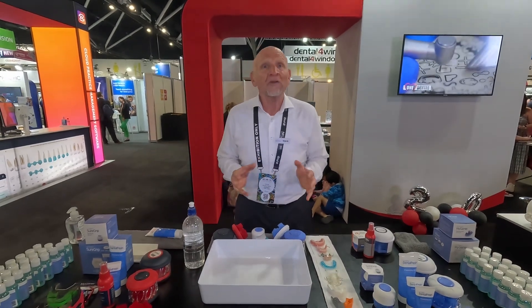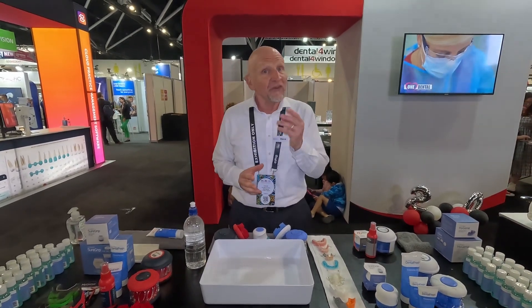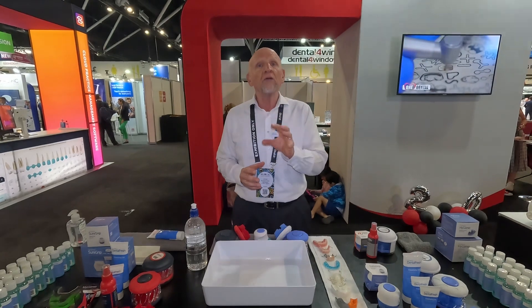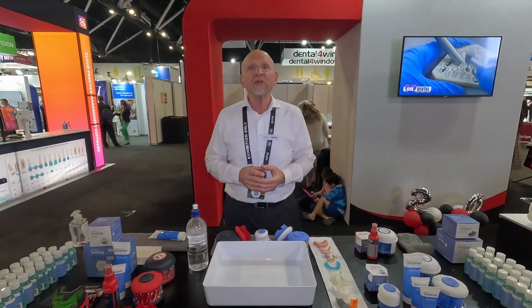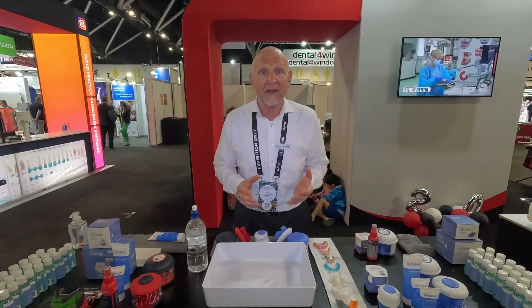In the next few minutes I'm going to talk to you about Dr. Mark's Hygiene, which is a one-of-a-kind, world-first system for the home and institutional care of removable dental appliances.